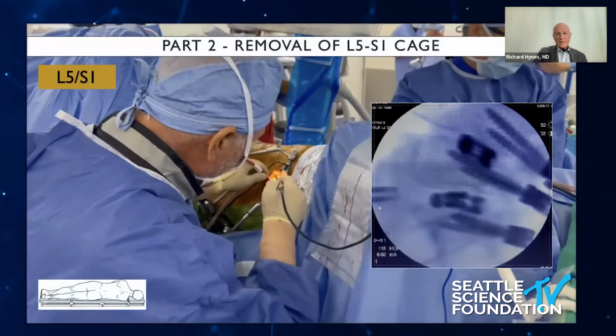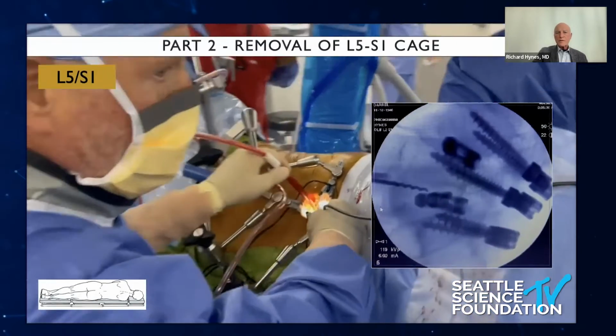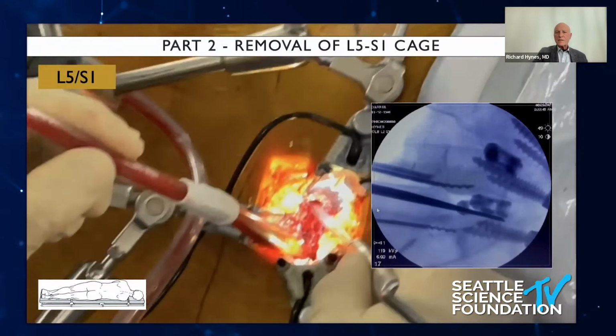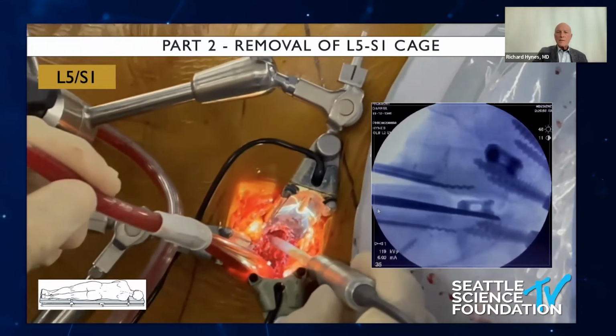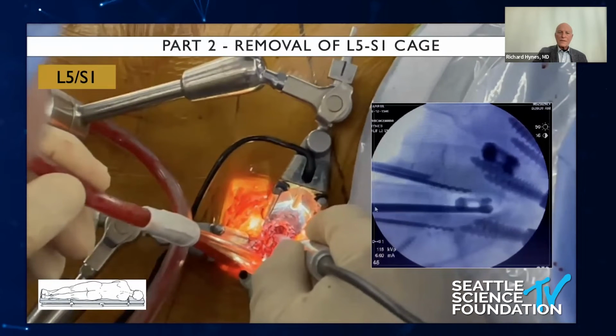And you can see this is the 5-1 approach. You get a really nice view. You're in a comfortable position. You're physiologically operating nicely. And you can see how nicely these cages can be withdrawn. They weren't that hard. They were kind of floating anyhow, but this is a very safe way to do it in a fast and efficient way.